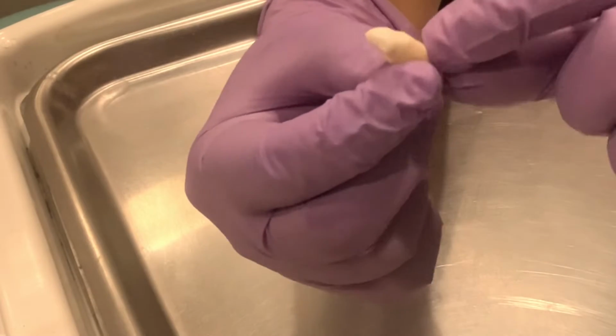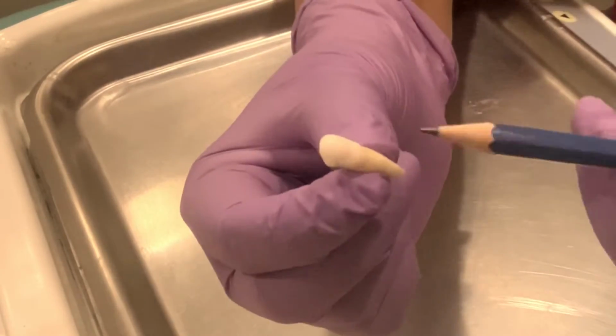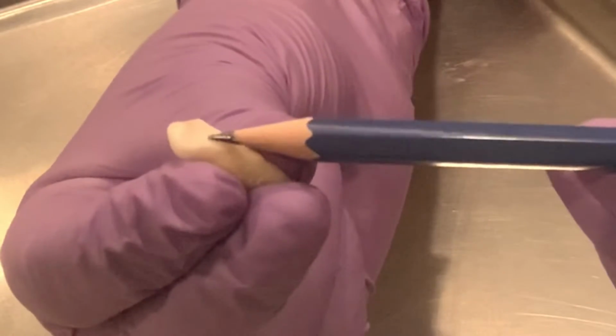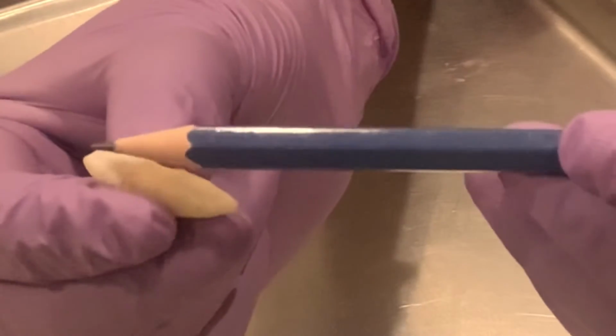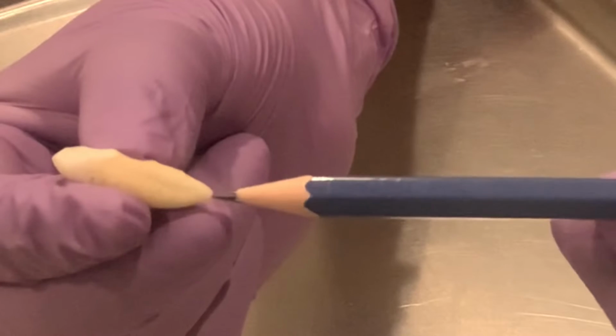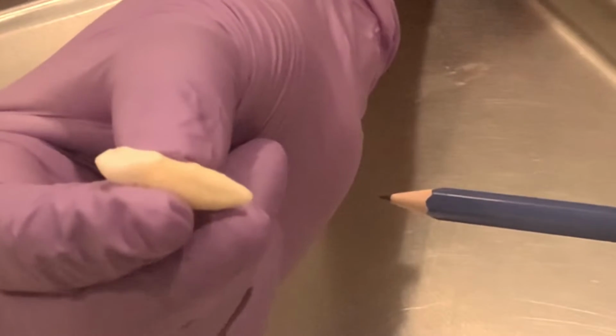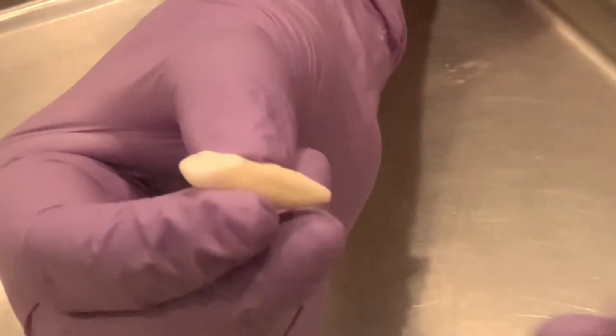Let's watch this tutorial on how to make an access cavity in a maxillary canine. This is an extracted maxillary canine. This is the labial surface, the palatal surface. The length of the canine is about 26 mm. It is the longest tooth in the mouth. The access cavity is made on the palatal surface.